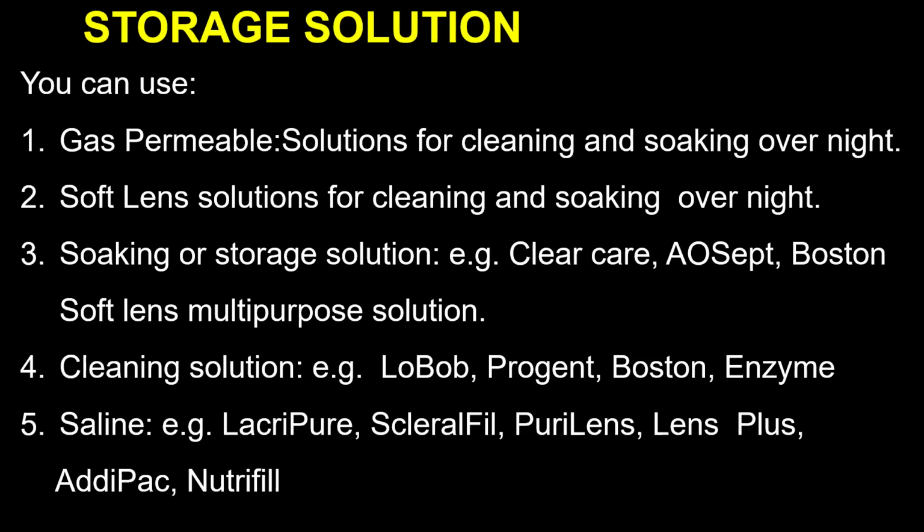In fact, we can even fit specialty contact lenses even for your regular cornea, like we call them, the smaller contact lenses. There's what we call segment modification in contact lenses, whereby you have two different base curves.